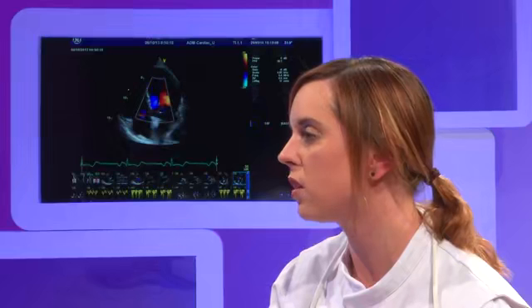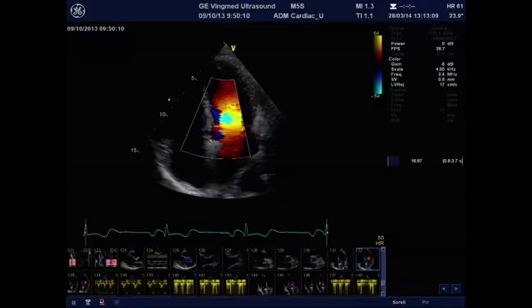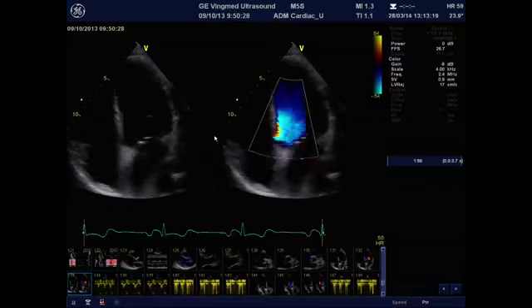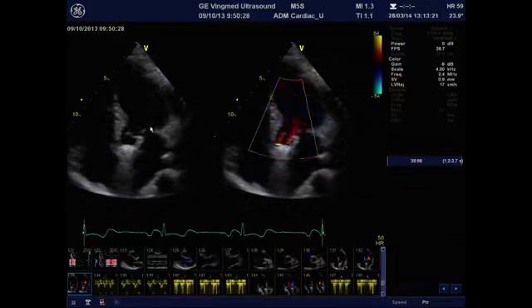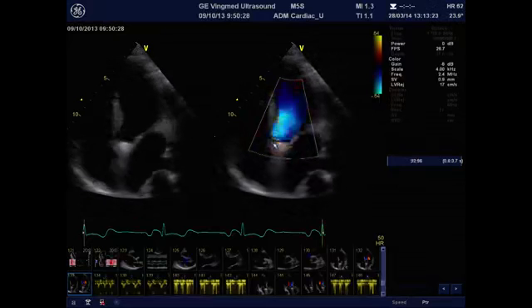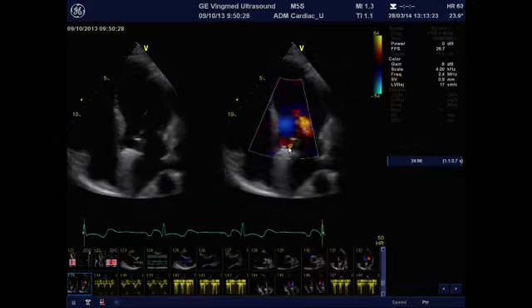I'm going to show it to you more slowly. So here you see the 2 small jets, just one here and the other one over there. And here, just to show you again, those leakages just over here, they are small, they are narrow, and they are symmetrical.